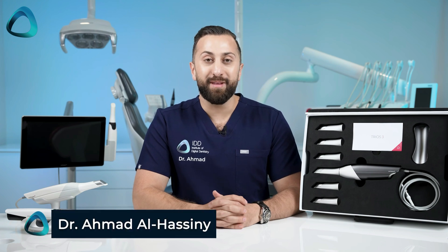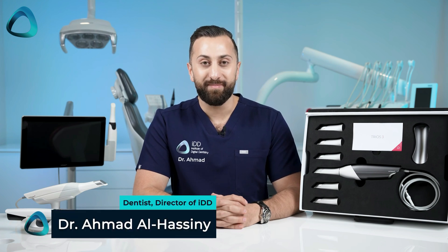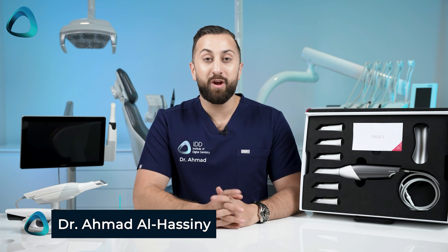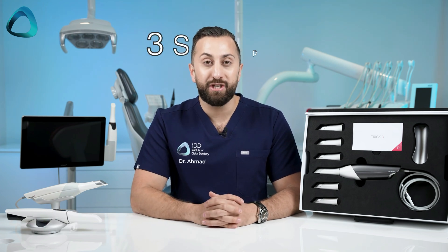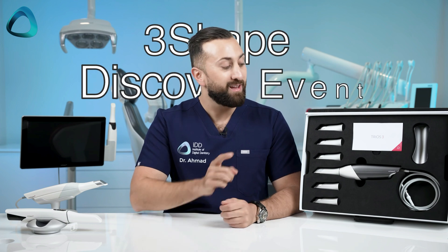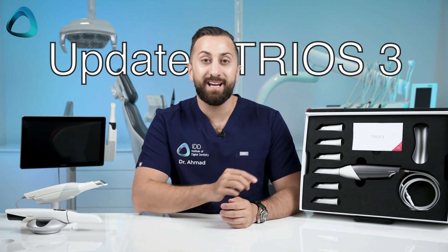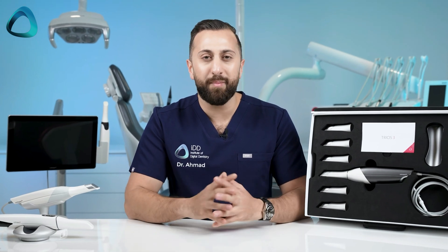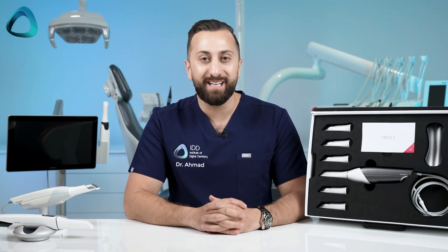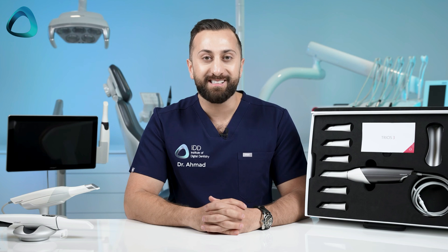Hey guys, Dr. Ahmed Al-Hasni here from the Institute of Digital Dentistry. In this video, we'll be going over one of the multiple big releases from the 3Shape Discover event, the refreshed and updated Trios 3. So what's new? What's in the box? And why was this released in the first place? Let's get into it.